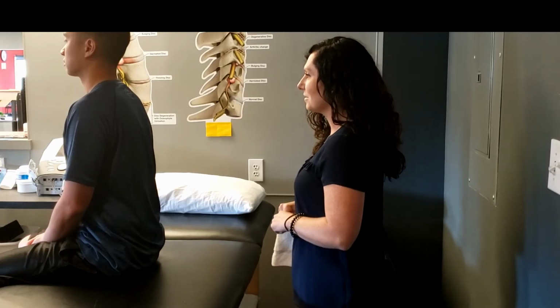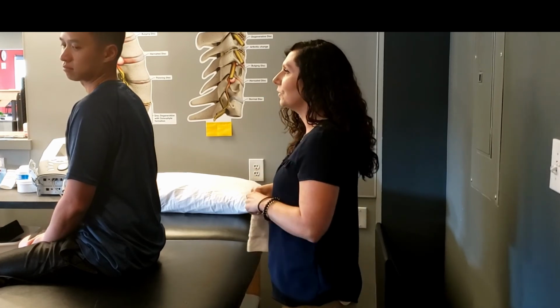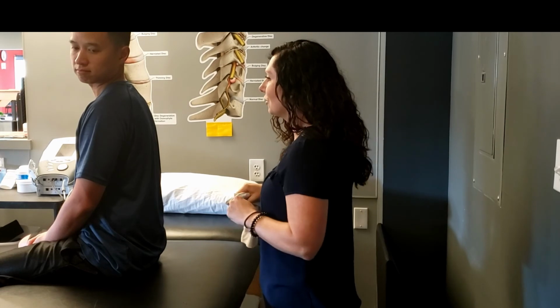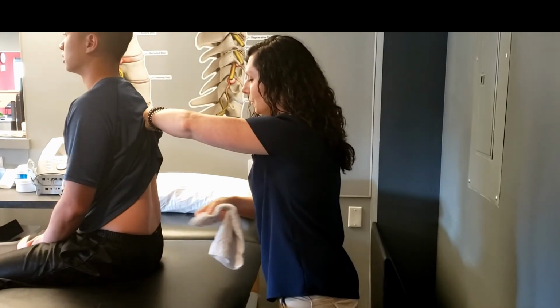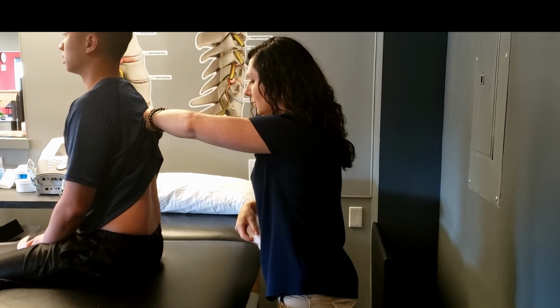I need to test your sensation. I'm going to do that by touching your back gently. You're going to tell me if you feel it on the first time or the second time. Is it okay if I lift your shirt? Yep. 1 or 2? 2. 1 or 2? 1. 1 or 2? 1.